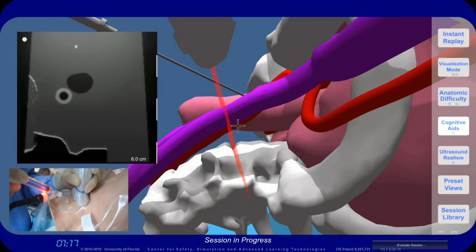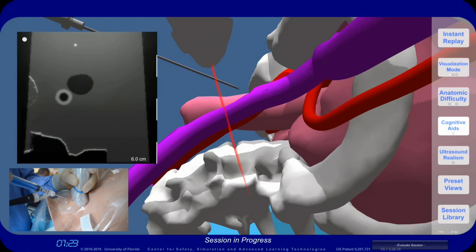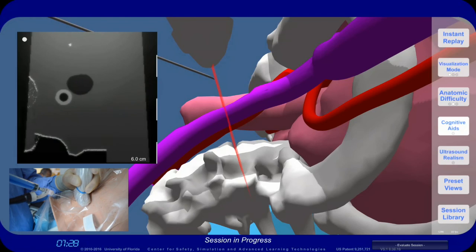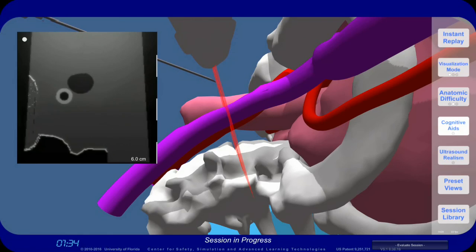To review, if you do not see the tip of the needle, you will need to withdraw the needle tip back until you lose the needle and then put the needle tip back in view. You can tell that you are looking at the needle's tip because it will look as though it is blinking in the ultrasound image. This blinking is caused when you move the needle tip in and out of the ultrasound beam, or if you rock the ultrasound probe forward and backwards.